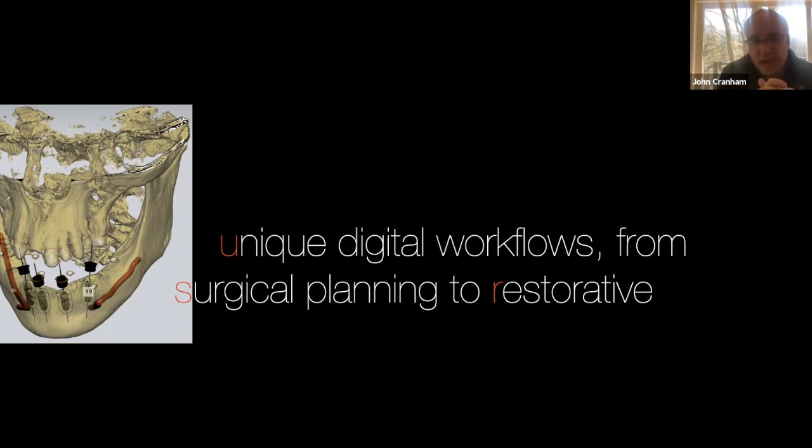So I have yet to see a patient walk in with no teeth. I haven't seen that yet. So they almost always have a denture. And even if it's terrible, I've taken now, I guess we've done like 4 cases together. Some of them are in preparation of implants, but this one lady is just a denture that we just did. And I'll tell you that when we first started doing this, this is the first case that I did, and she hated her denture, so I didn't think we should start with it. So what we did is we scanned the inside of her mouth, but the problem is when you start scanning the inside of the mouth, then you've got to get a bite, and there's nothing that comes together.